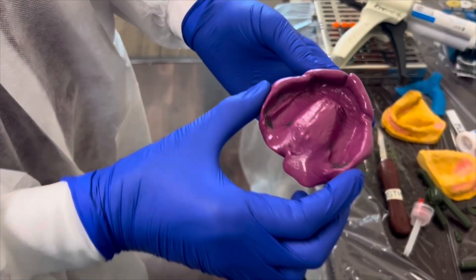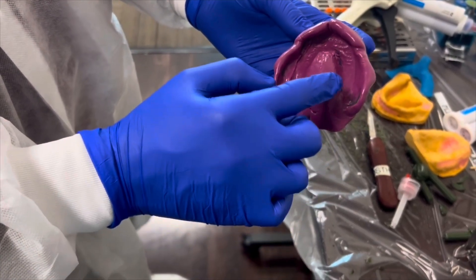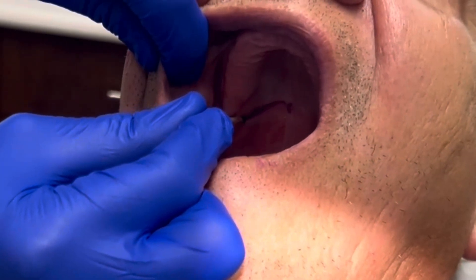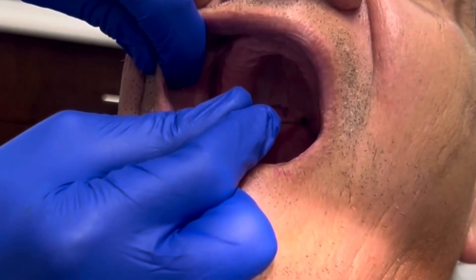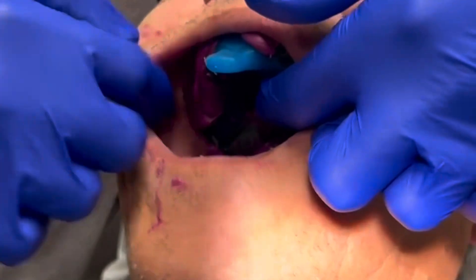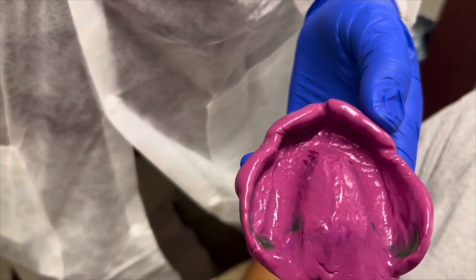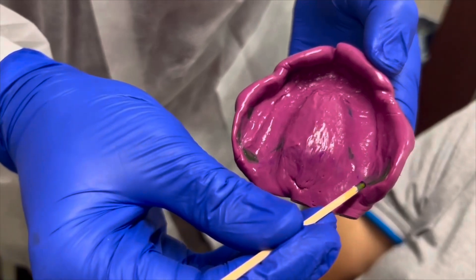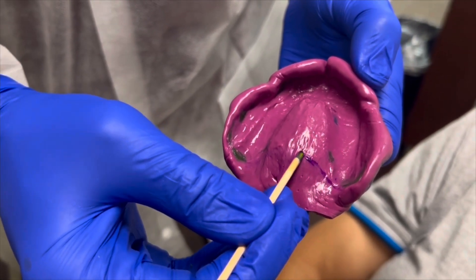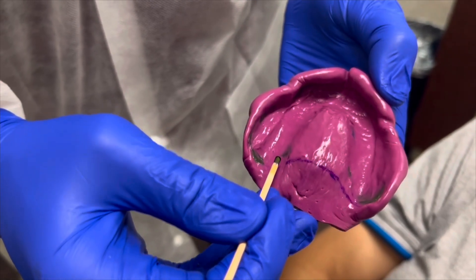Here is our completed final impression. You can see some minor show-throughs but overall it is adequate. I'm going to cut off a little bit of excess at the back. I usually like to mark the posterior palatal seal area one more time by marking it with a Thompson stick marker and seating the completed final impression into the mouth to imprint the color onto the tray. Because they're both purple, we may need to go over the existing line with the Thompson stick marker again so that the lab knows where the posterior palatal seal is.